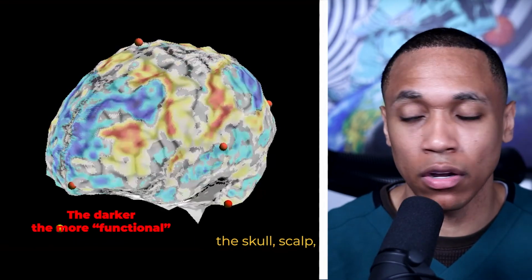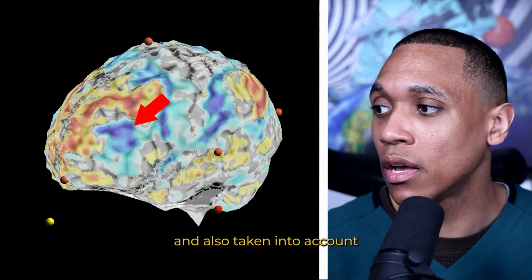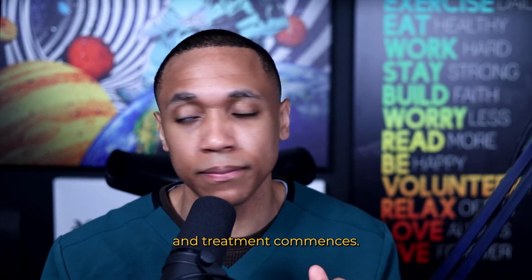I've taken into account the skull, scalp, and brain, and also taken into account the functional areas of this individual's brain. I place the coil in the right location and treatment commences.